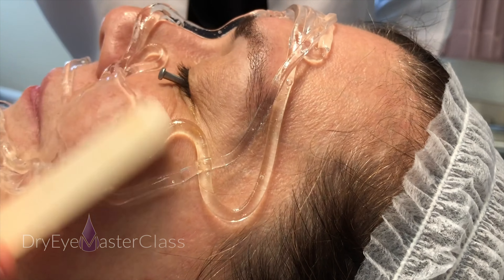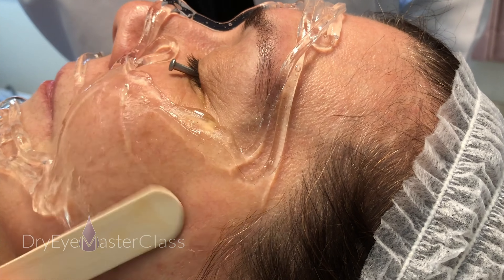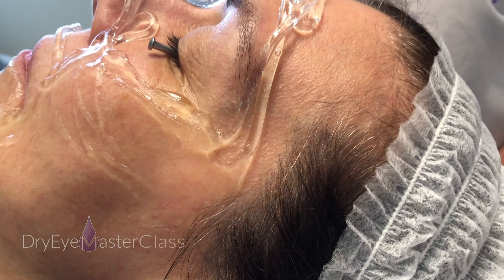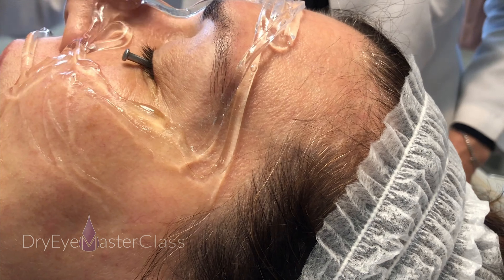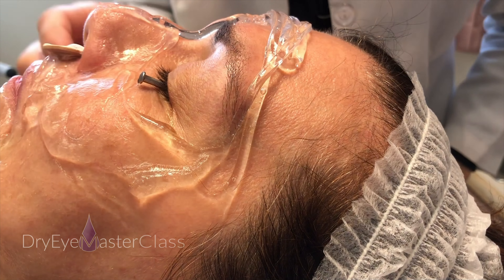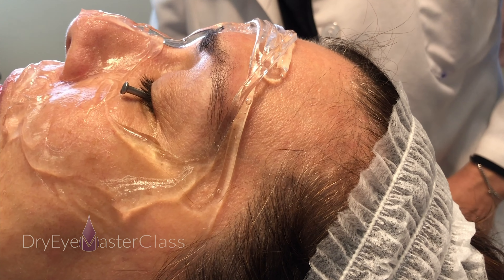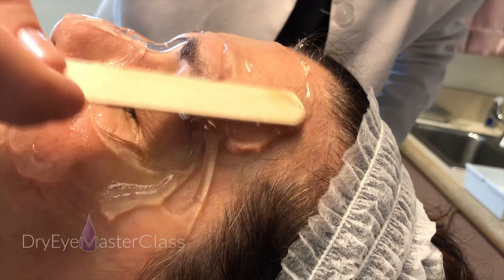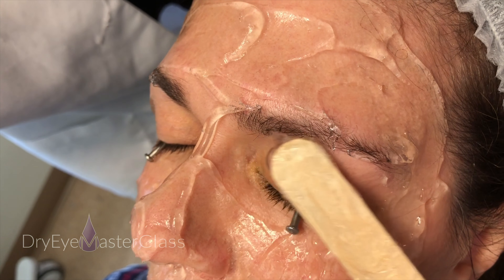I take my wooden tongue depressor — doesn't have to be anything special, your box of a hundred works really well — and I'm just quickly spreading a uniform layer across the face. You might feel a little tickle under your nose there.